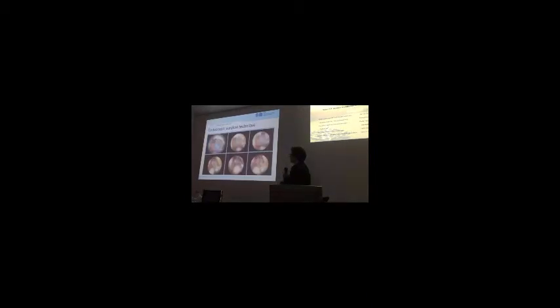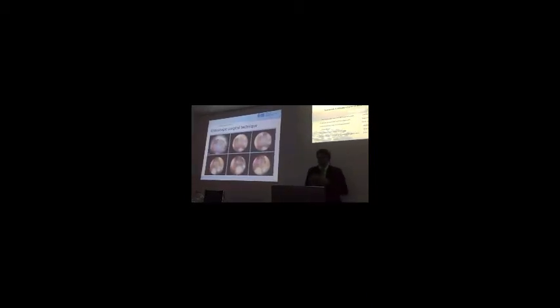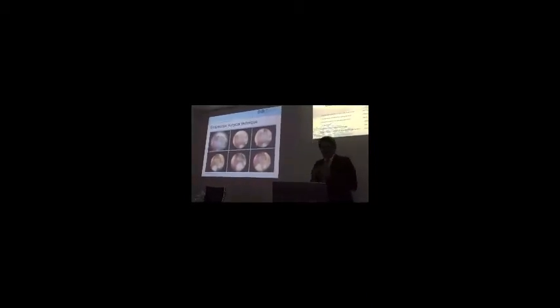So this is an idea of a lesion. So this is a typical colloid cyst. You see a significant hydrocephalus, and this is a more difficult colloid cyst. You see it's a little bit more posterior. Here's the foramen of Monro, and this is the approach we use. Some intraoperative images. This is a right-sided approach.